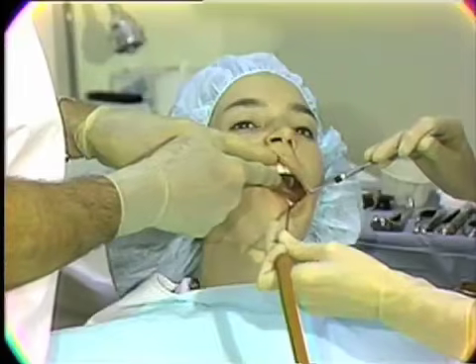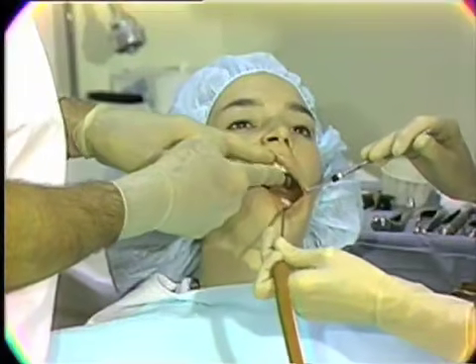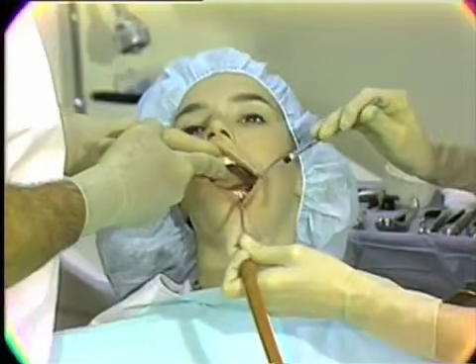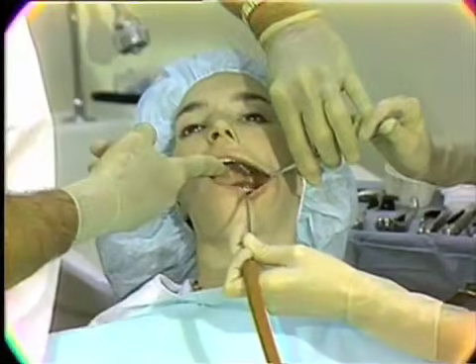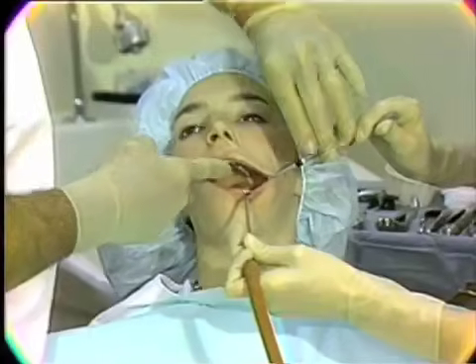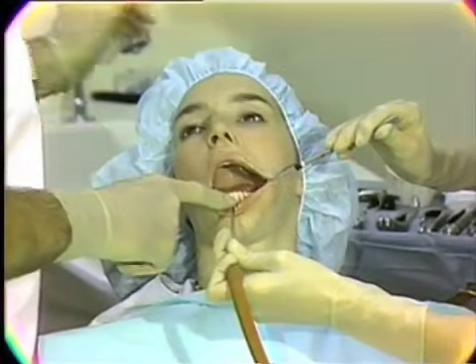You should explain to your patient that this is not what you want them to do, but rather to turn slightly toward you and to retain that position even though we are pulling their cheek in that direction. This will keep your field exposed so that you're able to operate.